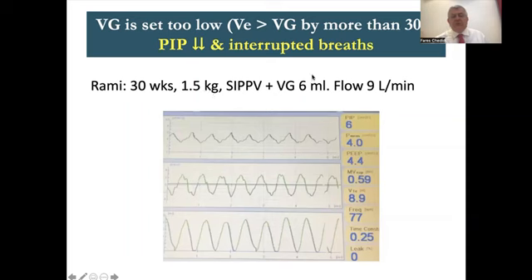The patient wanted more than 6 ml. He went and took 9 ml. He's 30 weeks and quite strong. He took 9 ml, which is more than 130% of what the VG is. So every time during inspiration, the machine would notice this is VTE, but VTI was also high. So during the VTI, at every breath, the breath will be dumped because he's taking 30% more than the VG.